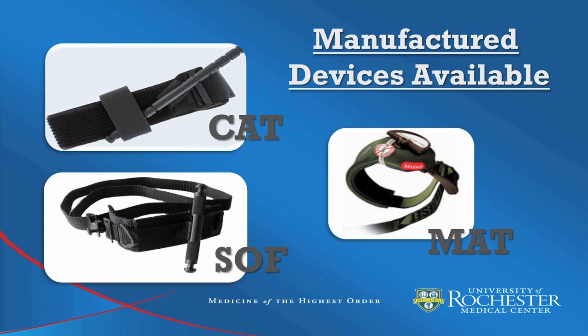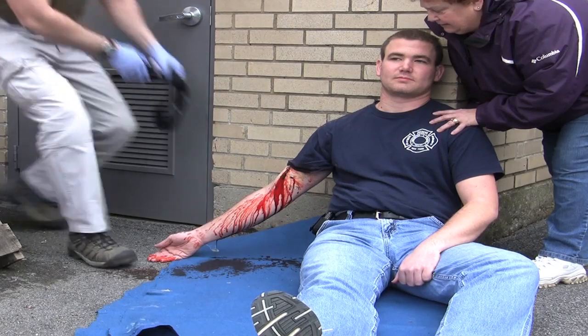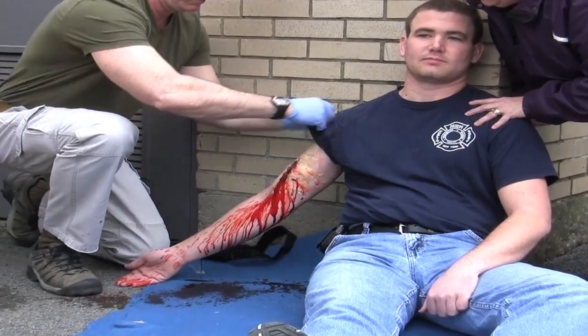The current tourniquet of choice for the military and many police departments is the CAT tourniquet, but the choice of tourniquet to carry and use should be discussed with your agency medical director. Today, we will be using and displaying the CAT tourniquet. Watch now as a rescuer applies a CAT tourniquet to an upper extremity with a life-threatening hemorrhage.